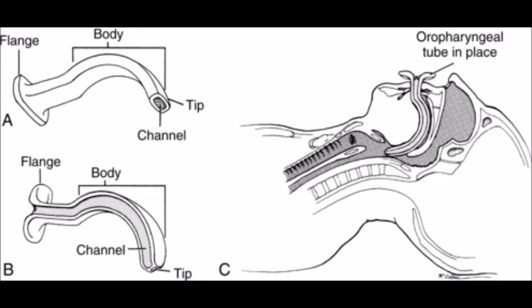In this video I'm going to demonstrate the correct way to insert an oropharyngeal airway. The parts of the oropharyngeal airway are the flange, body, tip, and airway channel.